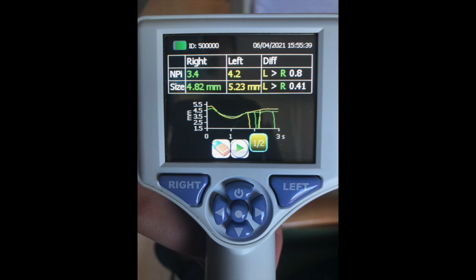Before diving into what these numbers mean, I want to emphasize the importance of having a baseline reading for high-risk patients on the pupillometer from when they're first admitted to the unit. Now, the first screen looks at two different things: NPI, or the Neurological Pupil Index, which shows pupil reactivity. This is the main number we pay attention to.